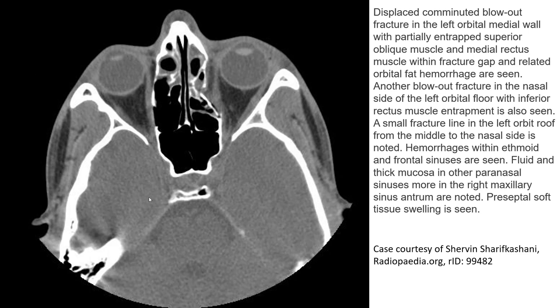Let's see another case of orbital fracture involving the medial orbital wall, with entrapment of the superior oblique muscle and medial rectus muscle within the fracture gap, and related orbital fat hemorrhage.